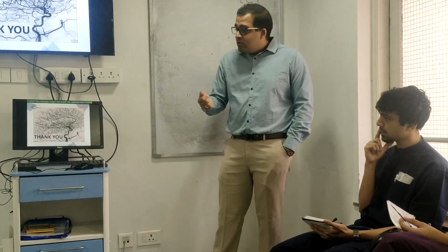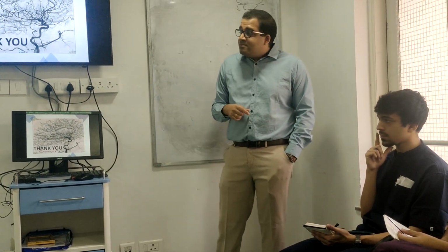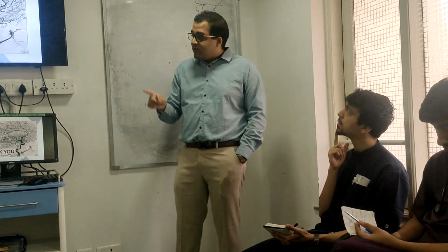How? Without opening. Without opening, how do you put? इसमें cap है ना? नहीं cap निकालने के बाद directly कर सकते हैं. हाँ, so that is the wrong thing. Why? Because this has been lying in your ward for days, months, you don't know. Now it is colonized with bacteria.